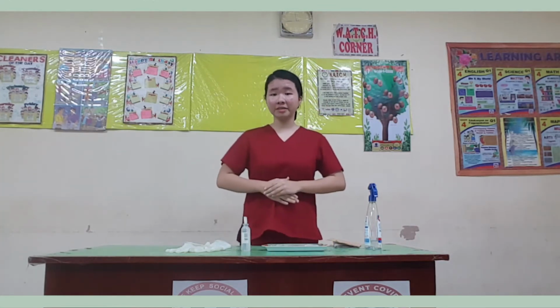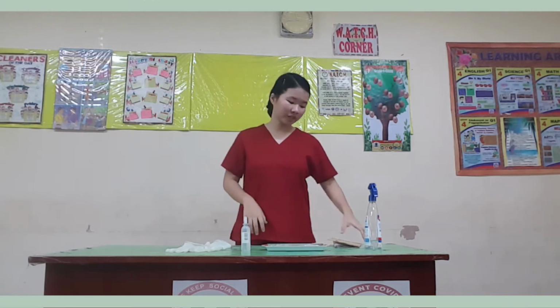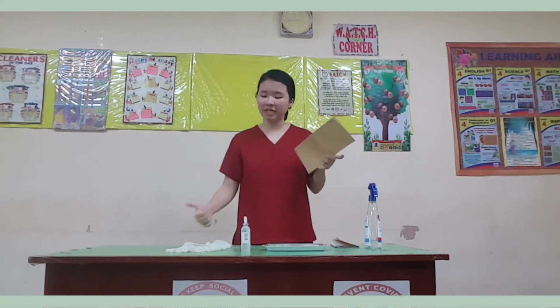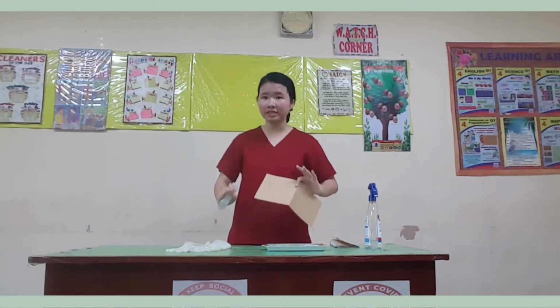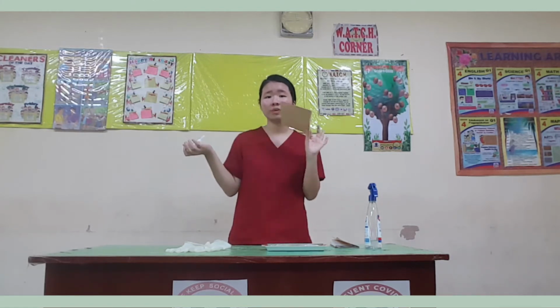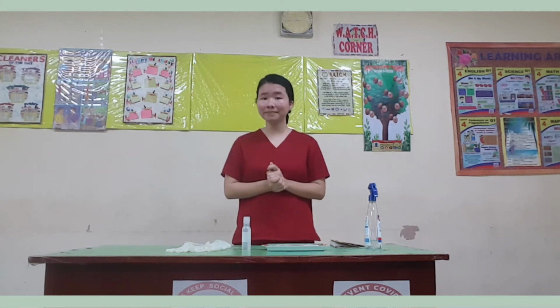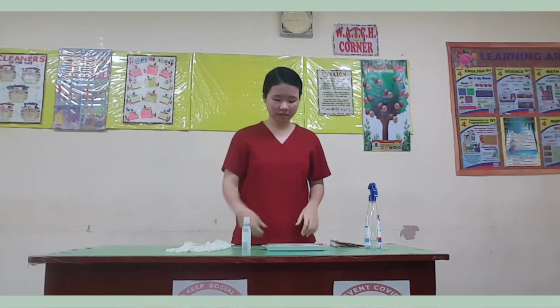For procedure number 7, perform the standing 3 checks of the drug together with the medication ticket. It is when it is taken from the medication cart, before withdrawing the medication, and after withdrawing the medication. This is to ensure that the right medication is to be used and to avoid errors in administering the medications. So we've already checked it a while ago before it was taken from the medication cart, and now and for later. For procedure number 8, compare the medications and calculate the dose properly. This is to avoid overdose or less dosage.